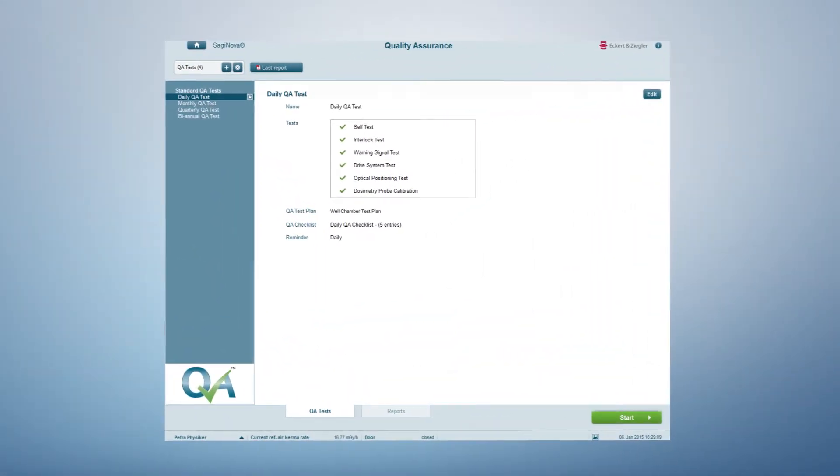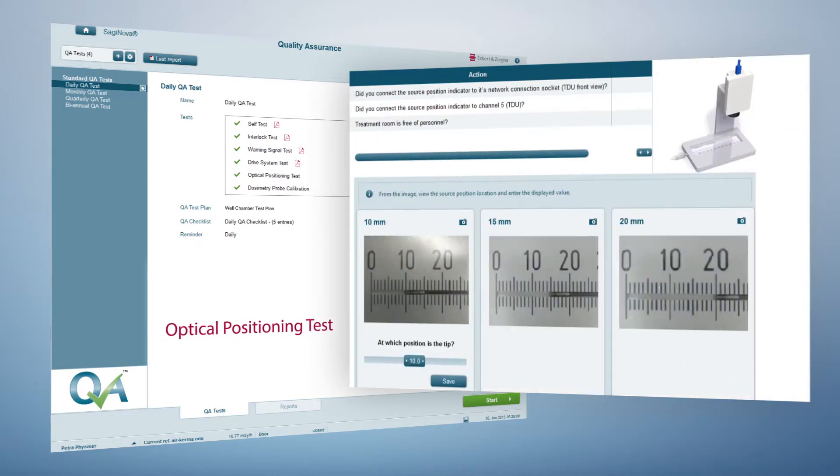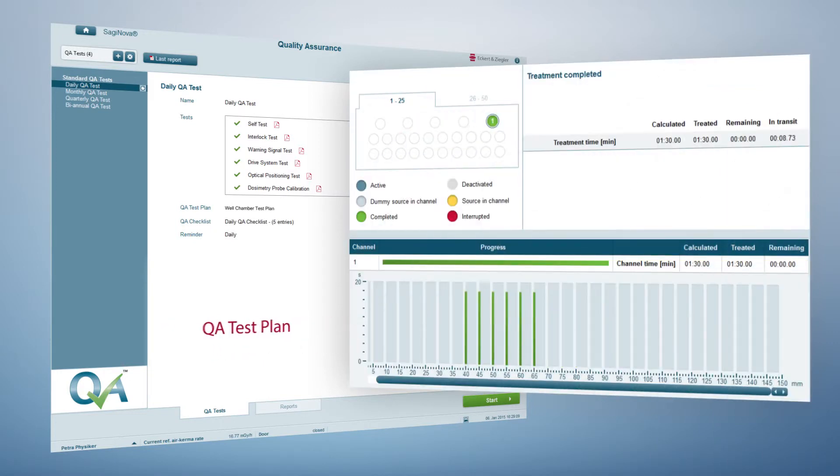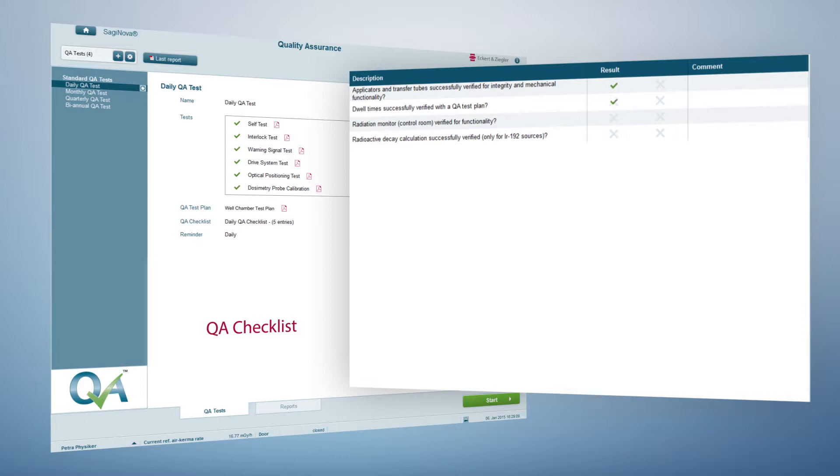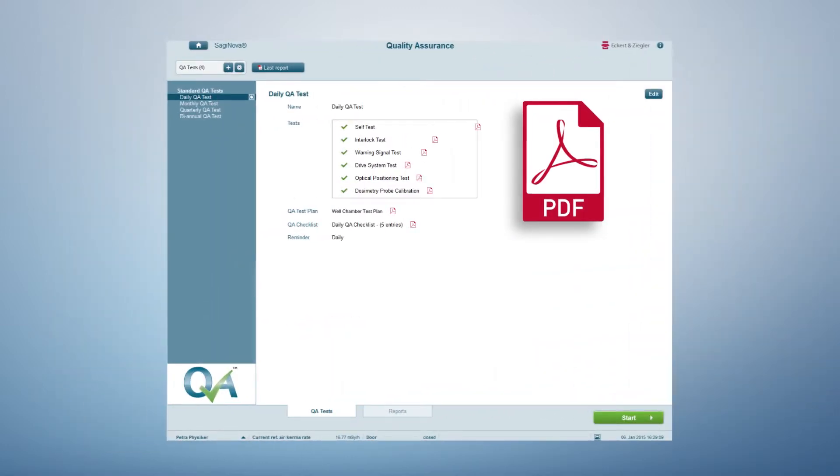Q-Assist is operated from the Saginova workstation. The highly customizable tool supports the user in adhering to the highest quality assurance standards. Q-Assist tests are performed in sequence and consist of different function tests that verify whether the system and critical components are operating correctly. Q-Assist supports full digital documentation, and the complete data is summarized in a PDF document.